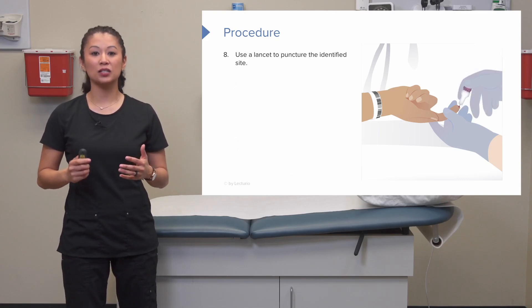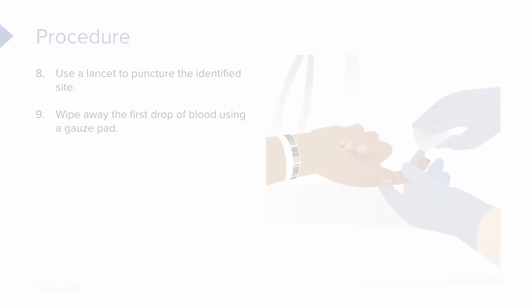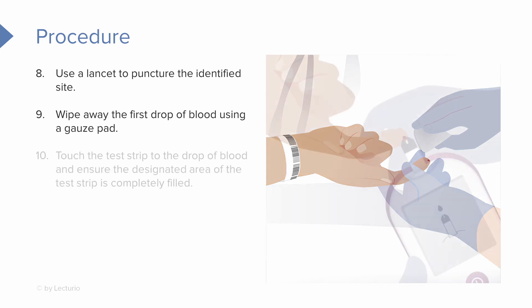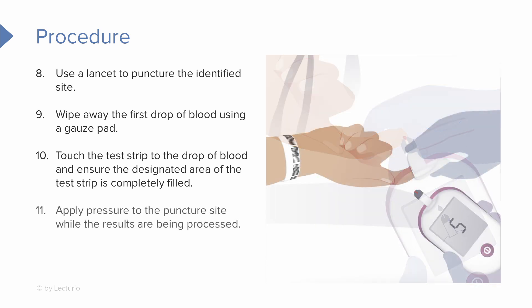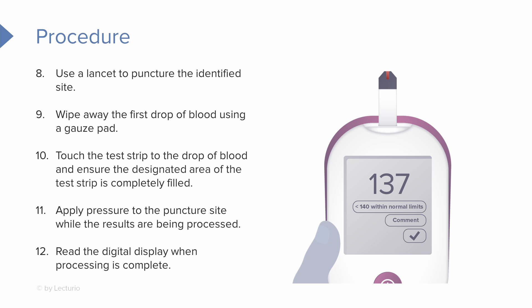Use the lancet to puncture the identified site. An important step many students forget: wipe away that first drop of blood using the gauze pad or cotton ball, as it may be a contaminated sample. Then touch the test strip to the next drop of blood, making sure the test strip area is completely filled. Once filled, the meter will start processing results. Apply pressure to the puncture site while waiting, then read the digital display when processing is complete.